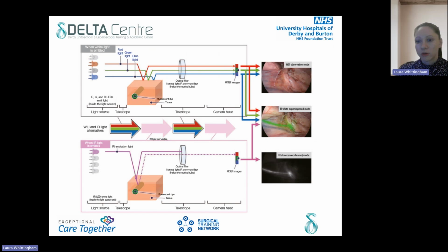And then if you look at this slide, this illustrates how it's combined with the normal white light imaging and the ICG near infrared imaging. So what you can do is lay the two images on top of each other, which is the central image here. And you can flick between having ICG mode on and off, so using the standard normal white light imaging.